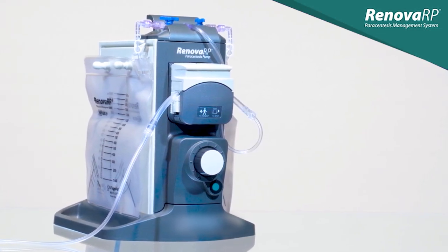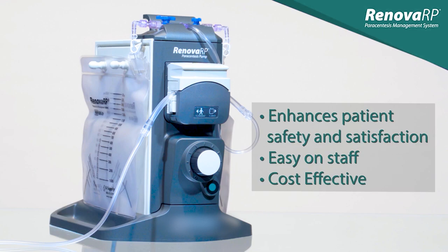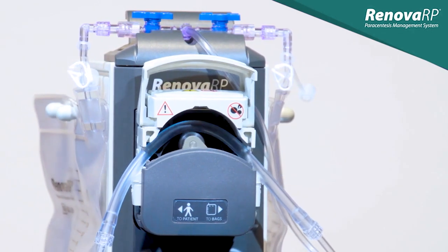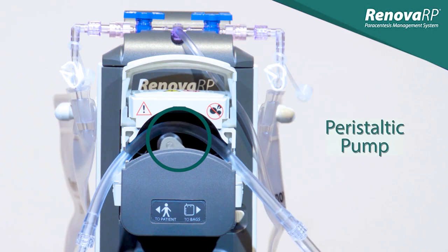Renova offers many benefits to both staff and patients. It enhances patient safety and satisfaction, is easy on staff, and is cost effective. Many of these benefits, including its efficiency and adjustable flow rate, come from the mechanism that drives the device: a peristaltic pump.